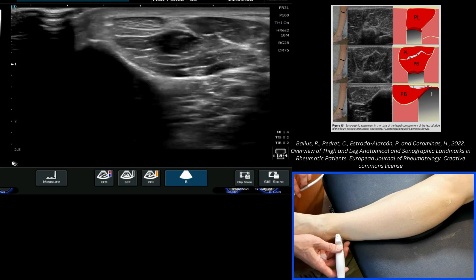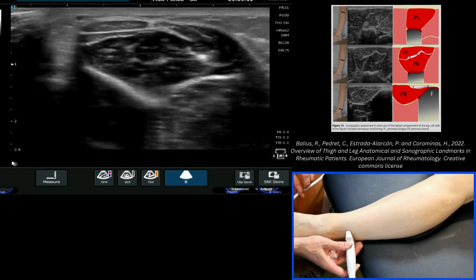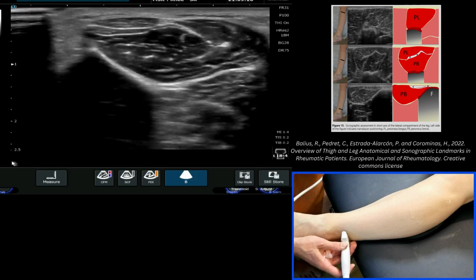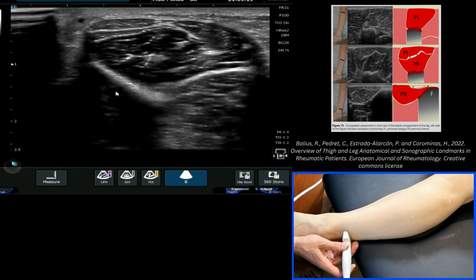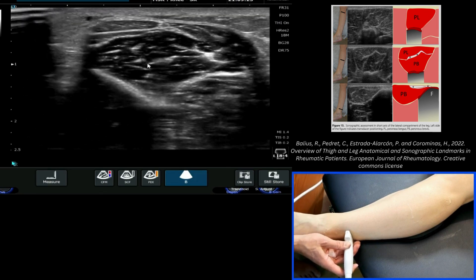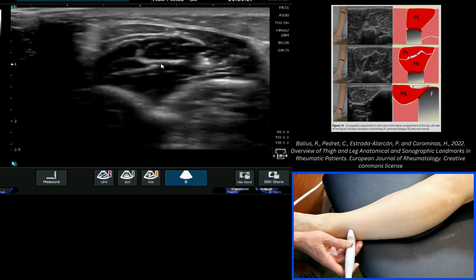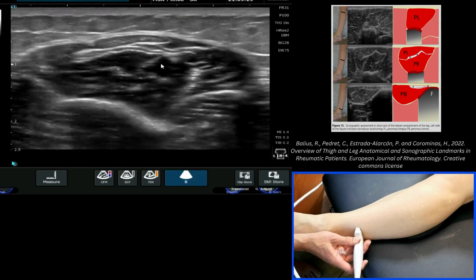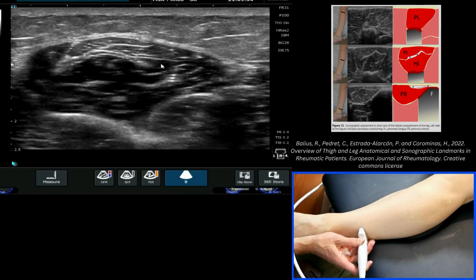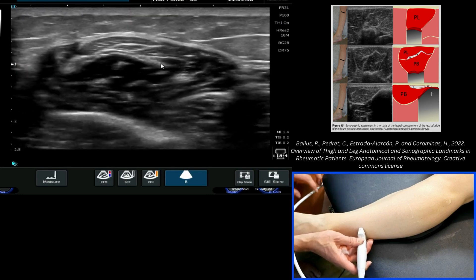If we start to move our probe slowly and steadily more proximally, keeping those structures nicely centered on screen using the appropriate frequency and depth, you can start to see — where my cursor is — the expansion of the peroneus brevis muscle. Continuing upward, we can see how the peroneus brevis muscle then starts to dive away onto its insertion onto the lateral aspect of the fibula.